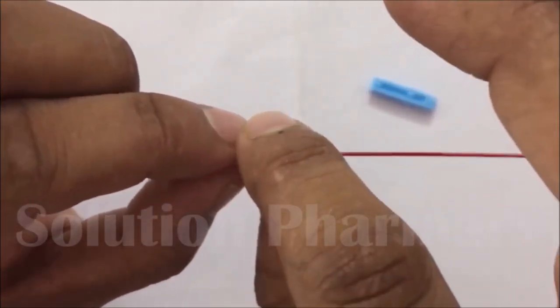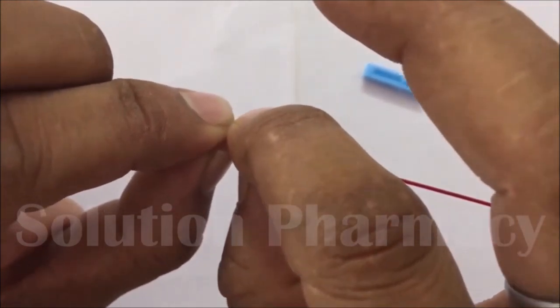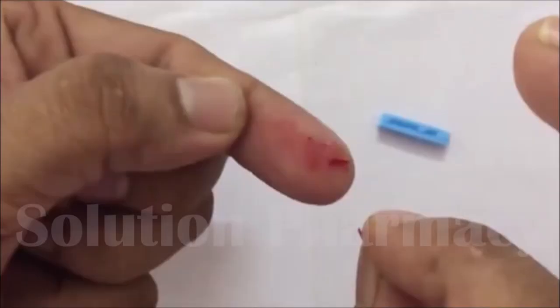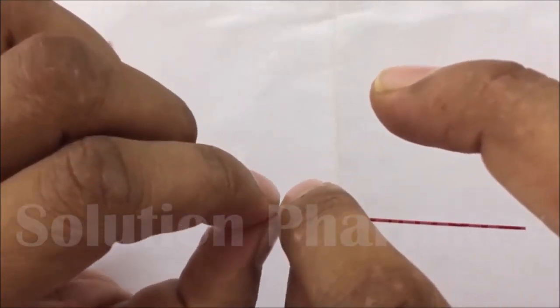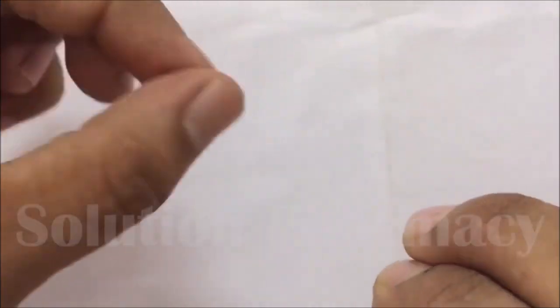After 30 seconds, carefully break a small portion of the capillary tube from one end, and then we have to observe the blood clot, meaning we have to observe the formation of a fibrin thread-like structure. Here you can see the blood clot is not formed. Again wait for 30 seconds and cut a small piece of the capillary tube again. Here you can see that the blood is not clotted. Again wait for 30 seconds.